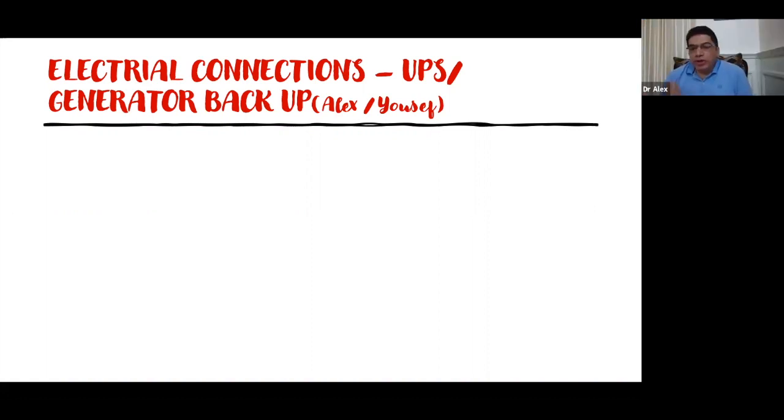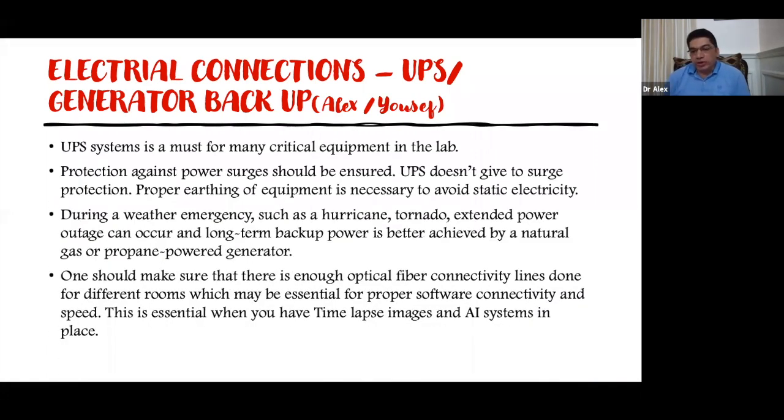Yeah, usually when somebody plans or designs the IVF laboratory, we give a lot of emphasis to the type of equipment, mostly incubators, what you want to get. But along with that, one should give more emphasis to the type of power system and the electrical integrity, and you should also do an analysis of the power of each equipment. That should be taken into consideration. All the vital equipment should be connected to an uninterrupted power supply, or UPS system. And you can also have a separate generator, especially in India. Power outages are very common, especially in the summer months, and that's a big issue.